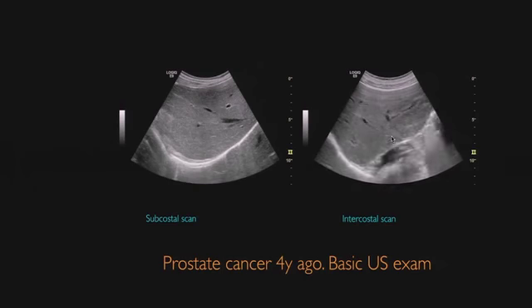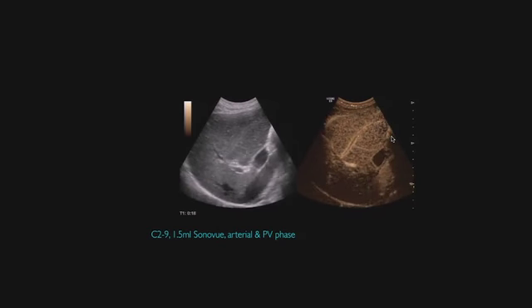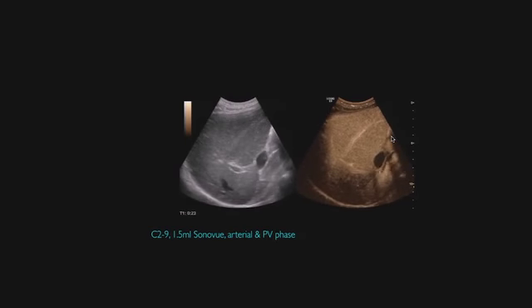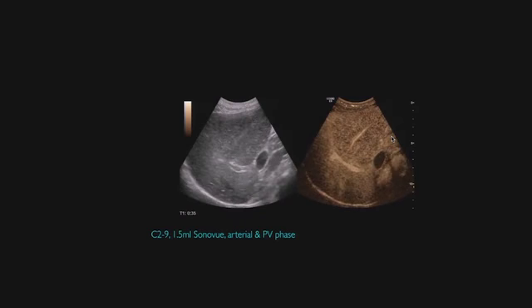And yeah, this is the arterial phase. And it's a classical finding. You can see the central arteries supplying this area, and you can see arteries branching from this main artery into the tumor tissue. Okay. So we have no real neovascularization, there is some neovascularization, but the major arteries are not destroyed. And you see it's starting to wash out.